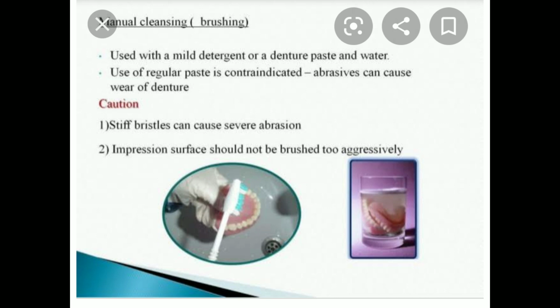Then how do they have to clean? They can clean by manual cleansing, that is brushing, with a mild detergent or denture paste and water, a mild abrasive, right? Remember, use of regular paste is contraindicated. Abrasives can cause wear of the denture.